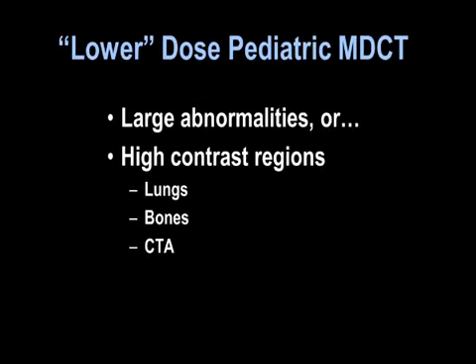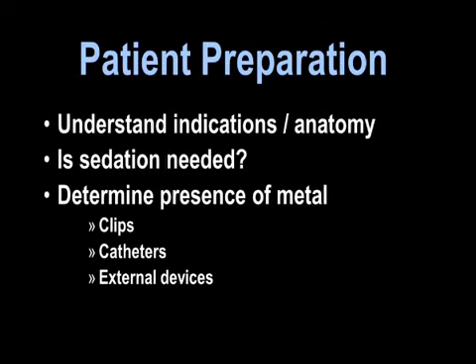Some of the lower dose pediatric MDCT that we come across are large abnormalities and follow-up scans where you already know something's going on, say an abscess search or an empyema, is it bigger or smaller. Also high contrast regions, lung, skeletal evaluation, and CT angiography.